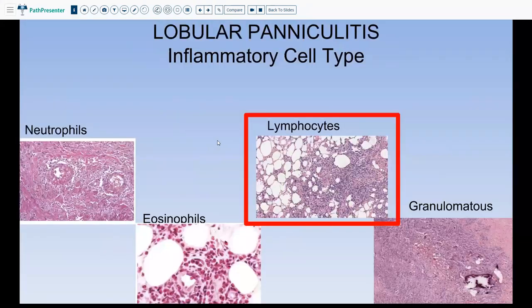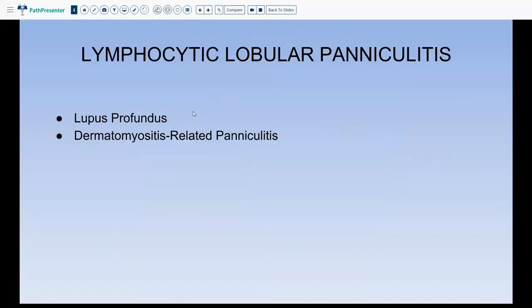Moving on, when you see predominantly lymphocytes in lobular paniculitis, you have to start thinking of connective tissue disease. If you see predominantly lymphocytes, think of lupus or dermatomyositis-related paniculitis.